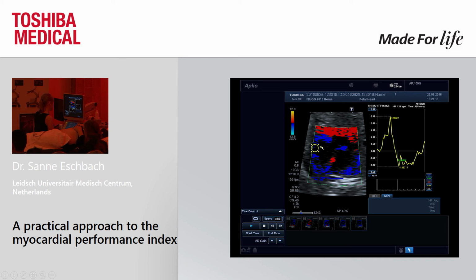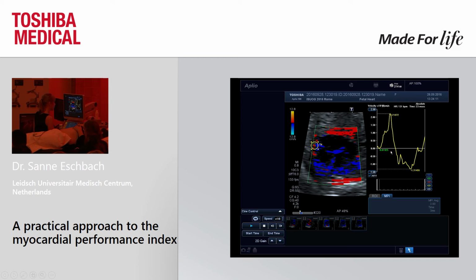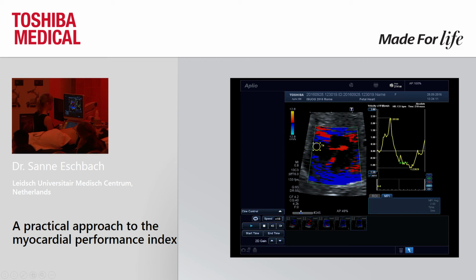Here you can see clearly the start of the contraction and the end of the relaxation and the end of the contraction. But it's more difficult to define where exactly the contraction time ends, I would say here. This would be the relaxation time, and this would be the contraction time.